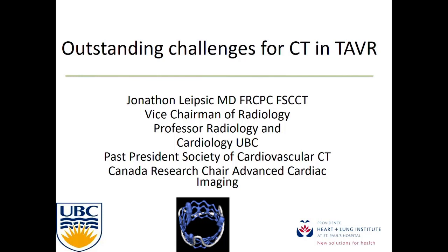What we saw from Dr. Waxman is the incredible outcomes that we're seeing in these large randomized trials. And I think there are three things that can be credited for those improvements. One, obviously first and foremost, is the refinement of the procedural skills of the interventionalist. If an interventionalist has more experience, she's going to do better with the procedure. The devices have also evolved and are frankly better than they were in 2007 and 2008, with a wider range of sizes. But I think we in the field of CT can take a lot of pride that we've helped better identify patients who are at risk for complications from TAVR.